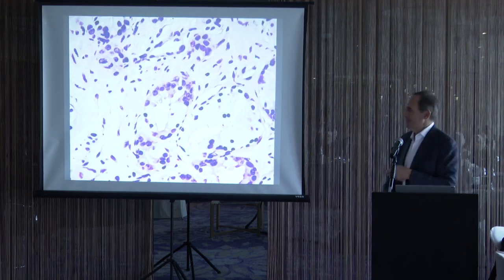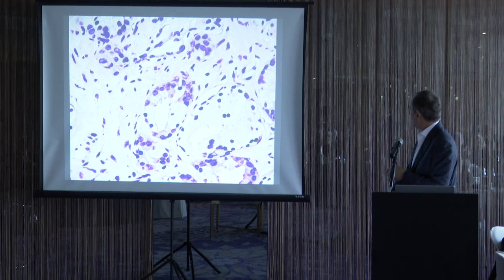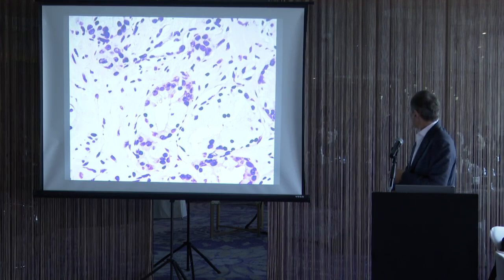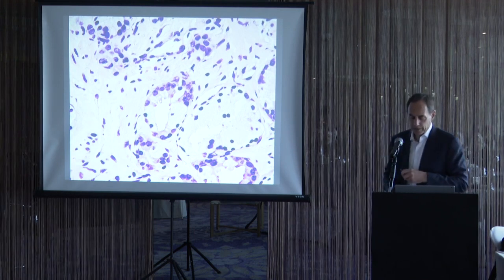Here's a case that literally in the same gland, we have some areas, some cells without foamy cytoplasm and some cells with foamy cytoplasm. And you can see that the cells without the foamy cytoplasm have big nucleoli, and once you hit the cells with the foamy cytoplasm, very bland cytology. So again, they always go together.